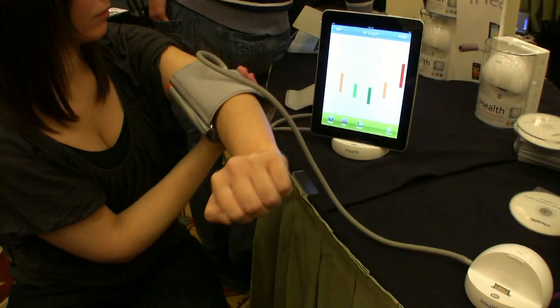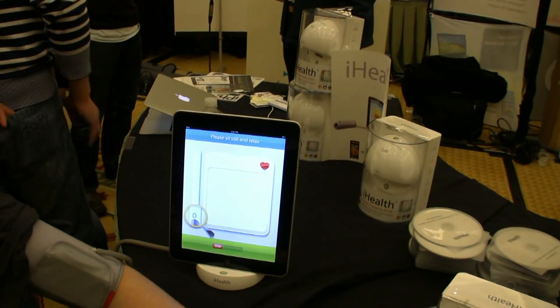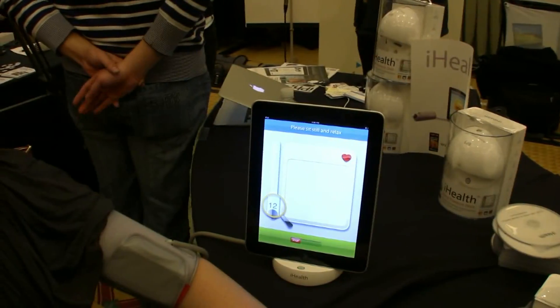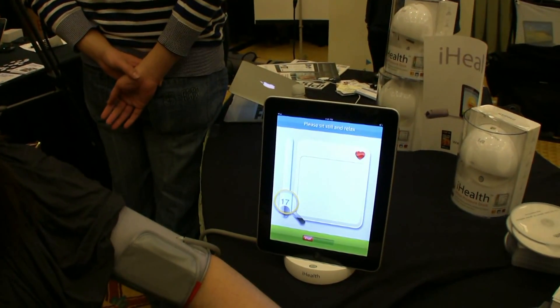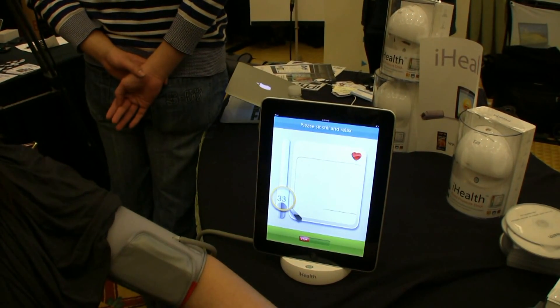It's really simple. I think you can guess what you have to do here. You just press the start button, and it's asking her to sit still and relax — any wild movements, laughter, or talking would adversely affect her results. So she's going to do that.